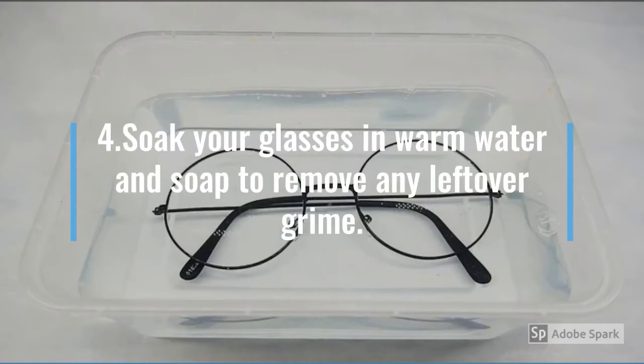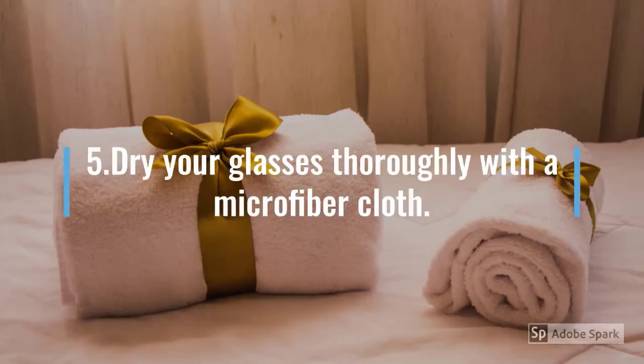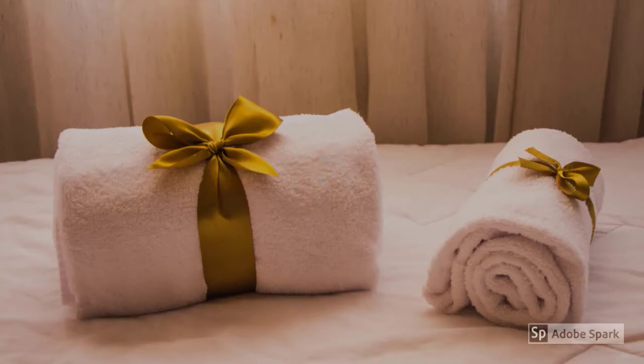Soak your glasses in warm water and soap to remove any leftover grime. Dry your glasses thoroughly with a microfiber cloth.